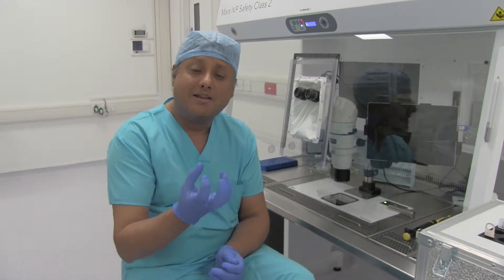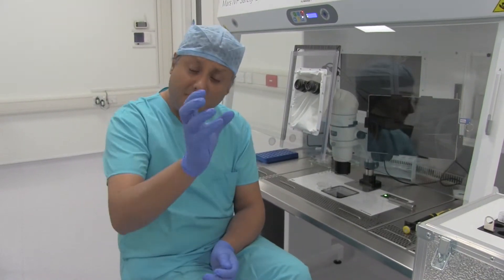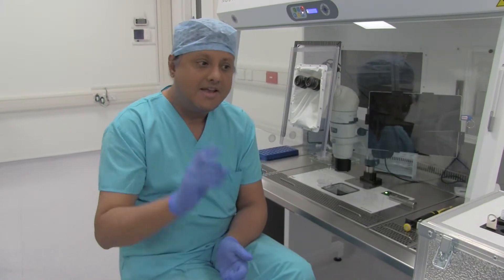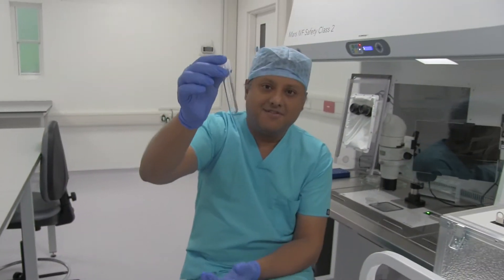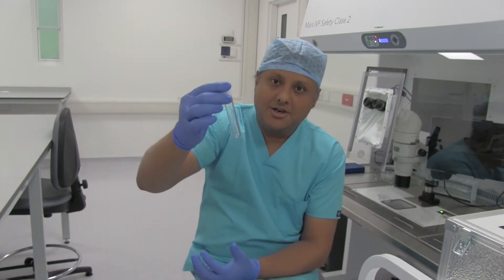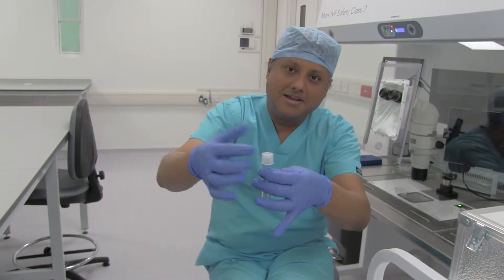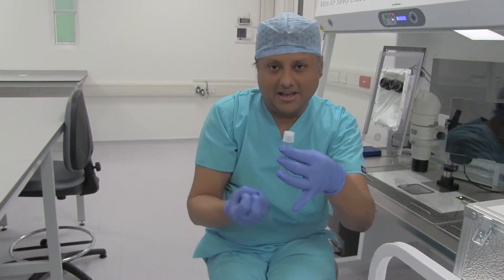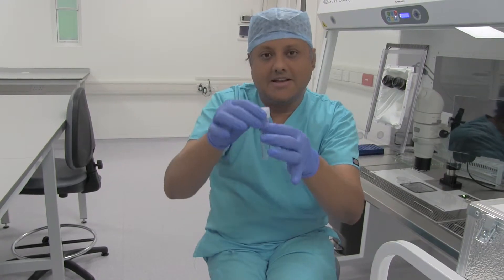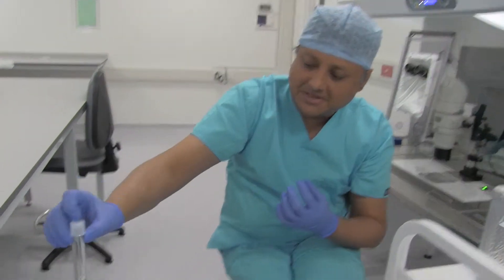The way this is done is by vacuum suction, with a gentle suction of about 100 millimetres of mercury. Each follicle is aspirated and the contents of each follicle are collected in these 15 ml tubes. The nurse is there in theatre holding such a tube, which has got the rubber tubing connected to the needle inside the ovary, and by vacuum each follicle is being aspirated and the tubes are filled with follicular fluid.